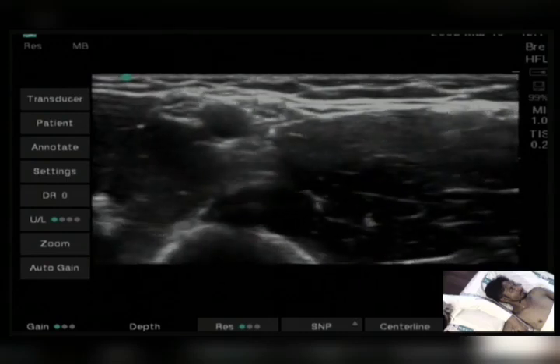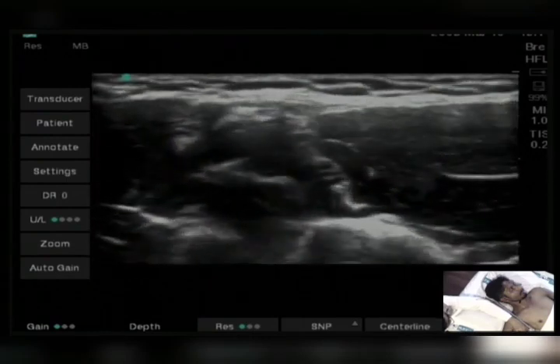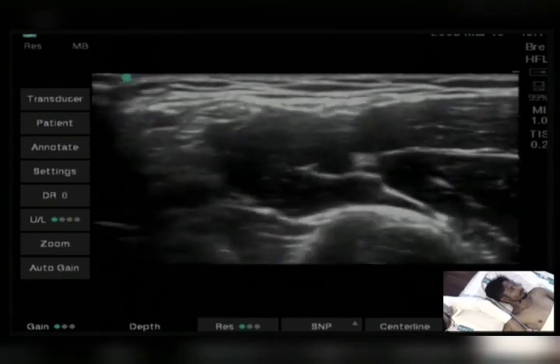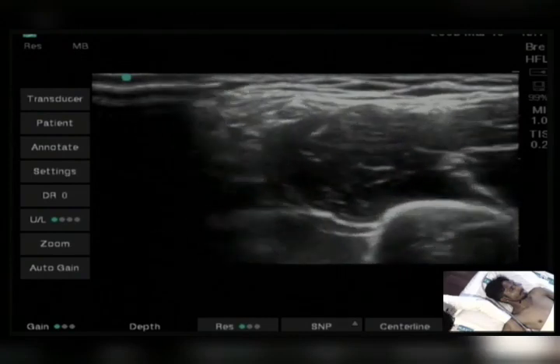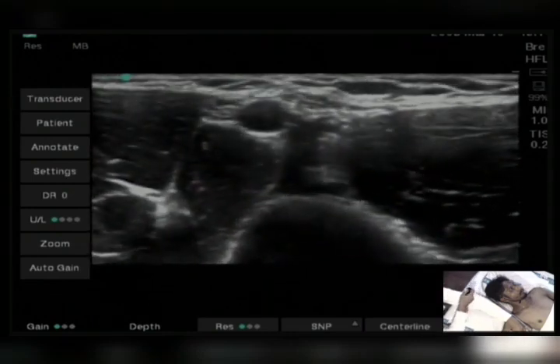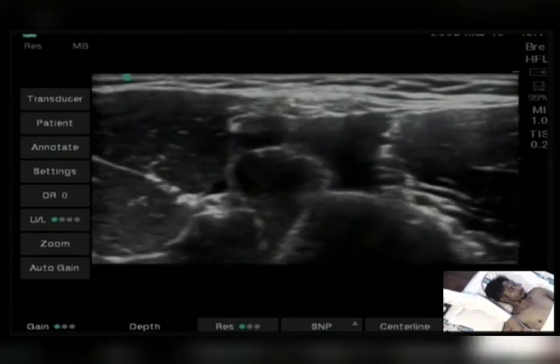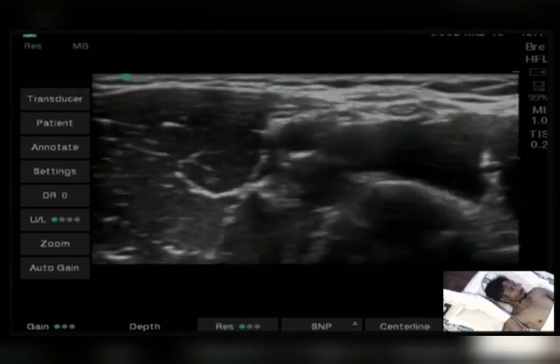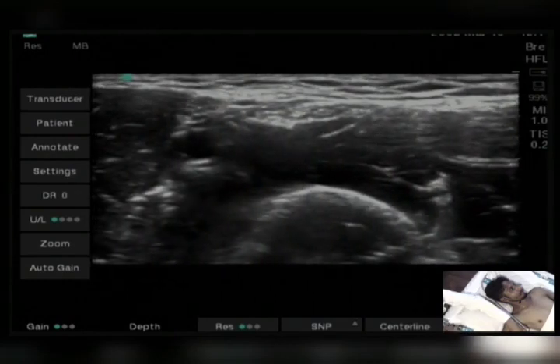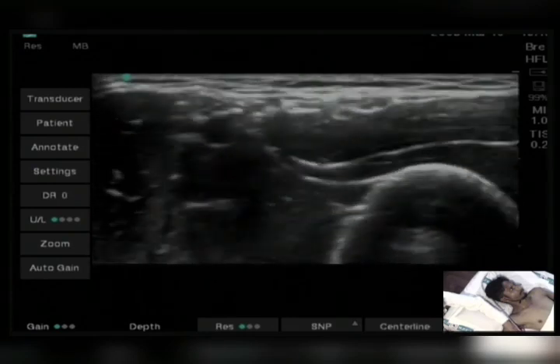Look at the 1 o'clock position, in that you will find the ulnar nerve. When we go distally, on the top of this is ulnar. When I go distally, it will leave the area of the axillary artery here, okay, and it will enter nearer to the medial epicondyle.